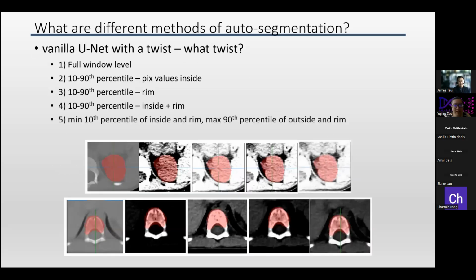Like this? Oh, sorry, not windowing. Yeah, this. Yeah, it's essentially windowing. So again, Hounsfield unit minus 1000 is like air. 500 and above is like bone, and the thousands, 2000s, are like implants.